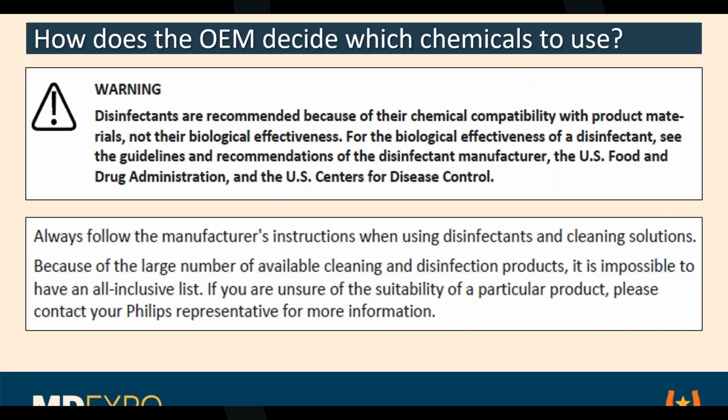So if somebody wants to use something different than what's listed, they should contact the OEM and not just say, well, it says here it kills bugs, so let's use that.